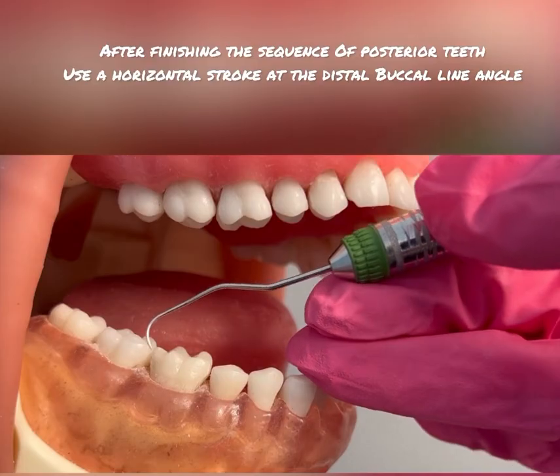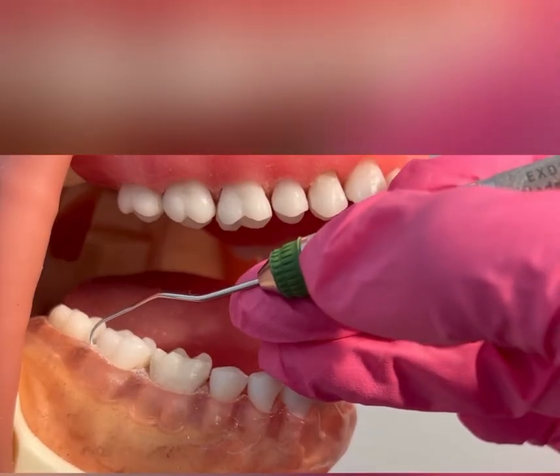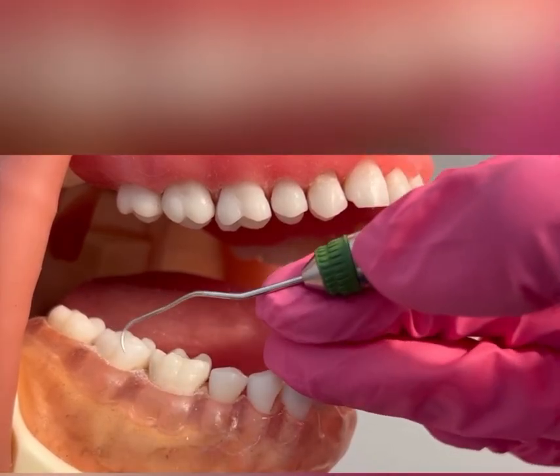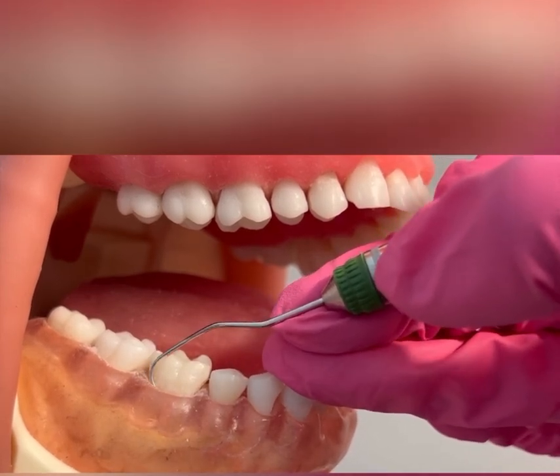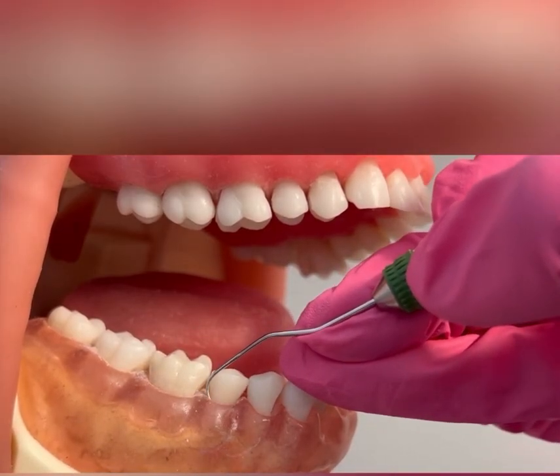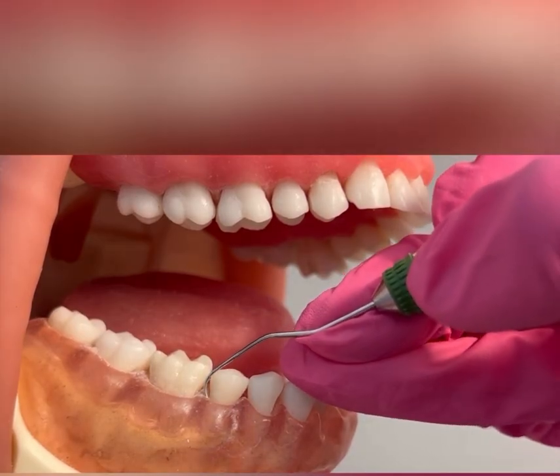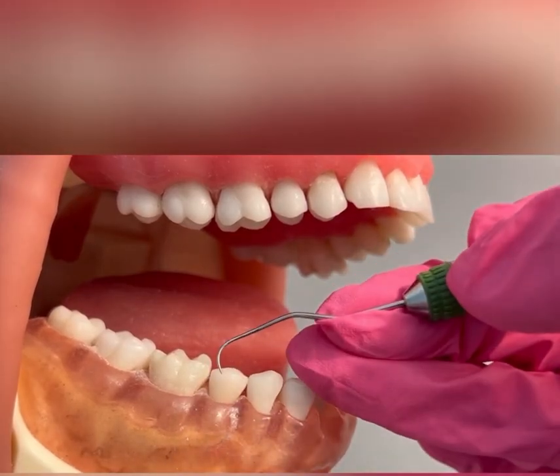Now I will go back and do a horizontal stroke right at that distal buccal line angle. I'm going to insert the explorer subgingivally and do only two or three strokes at the distal buccal line angle of tooth number 31 — a horizontal stroke right at the CEJ. The reason for this is that the distal line angles are a very commonly missed area for calculus. So you just want to go back and double-check those distal line angles with a horizontal stroke — about two to four strokes. And that's it.